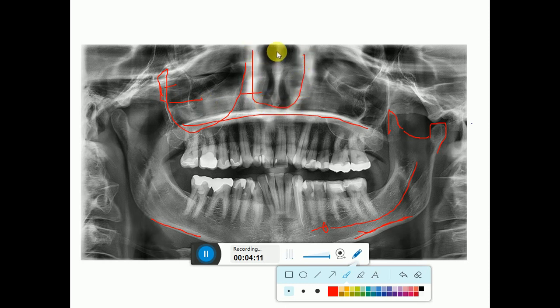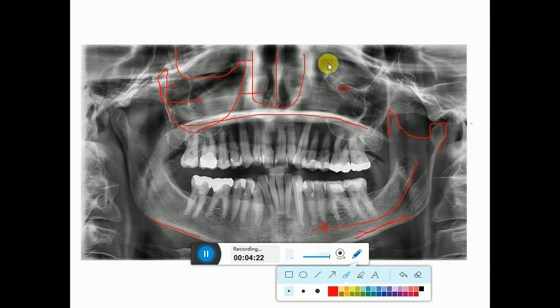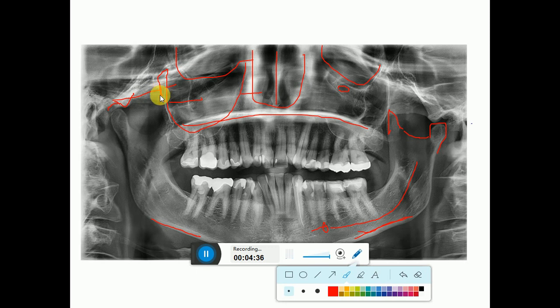This is the nasal cavity and this is the nasal septum. Here we can see the inferior orbital foramen, and here we can see the orbits on both sides. This is the articular eminence, and this is the condylar fossa.